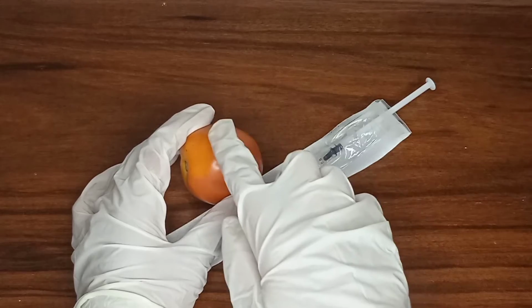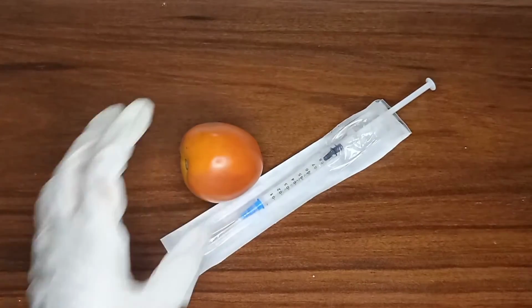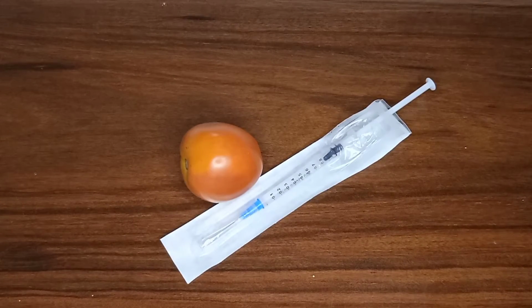We are going to clean the site with an antiseptic swab and start at the center of the site and clean in a widening circle to about 5 centimeters or 2 inches. Allow the area to dry after cleaning.